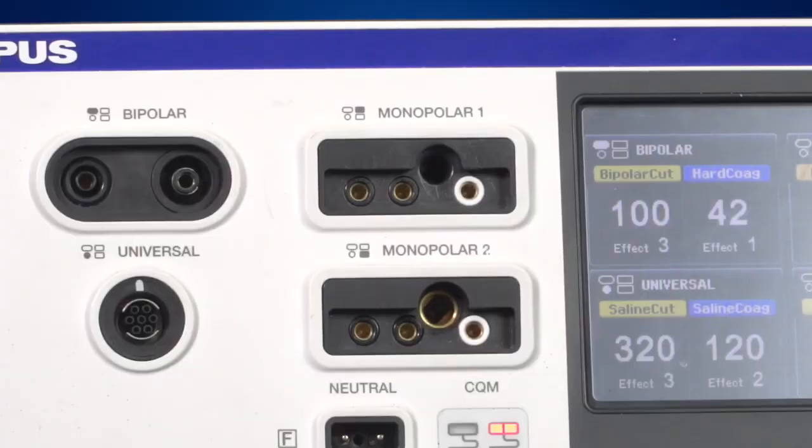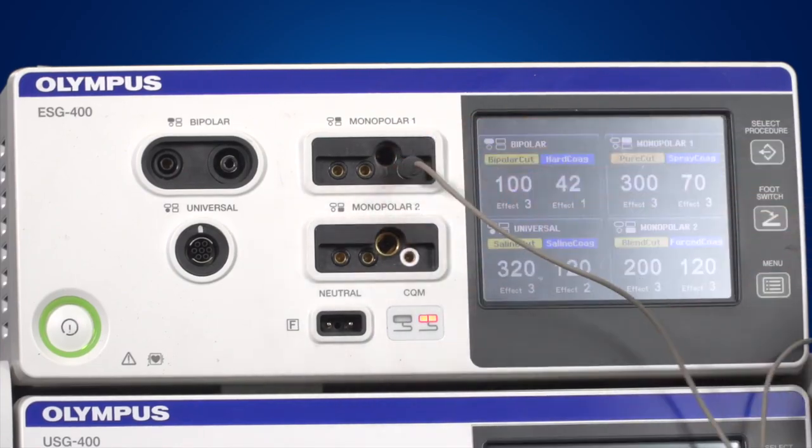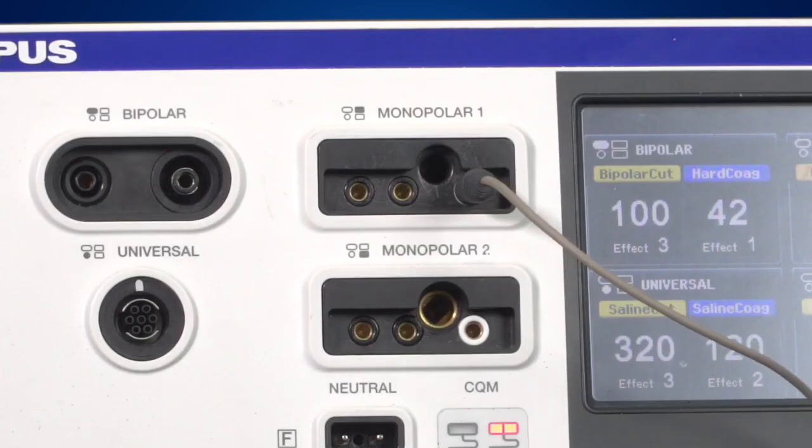It's important to connect the four millimetre banana plug into the correct socket. To do this, use the right-hand socket in the monopolar connection area. A white ring around the socket indicates that this is the right socket for the four millimetre banana plug. Connecting the four millimetre banana plug to any other socket may cause damage to the generator. Always try and remember that white is right.